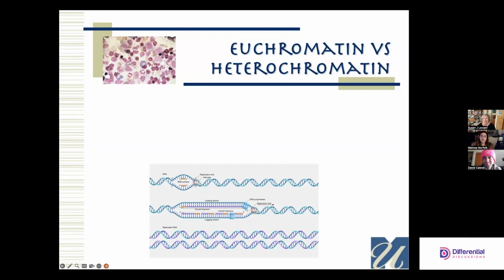Today we are here to talk about chromatin. You have been asking us to talk specifically about what we mean by clumpy chromatin versus soft chromatin. So we have a guest today, Dr. Susan Leclair, who's going to clarify for us what exactly we mean when we talk about chromatin patterns. So welcome, Susan. Thank you very much. Although clarify is always kind of a daunting title.